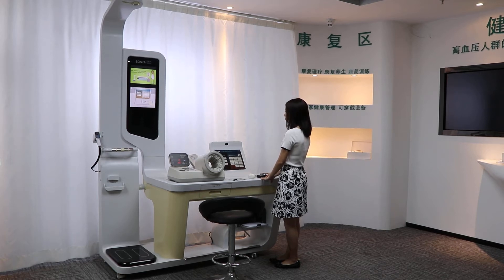This is a Health Check Station THX demonstration. This machine can provide one-stop service.